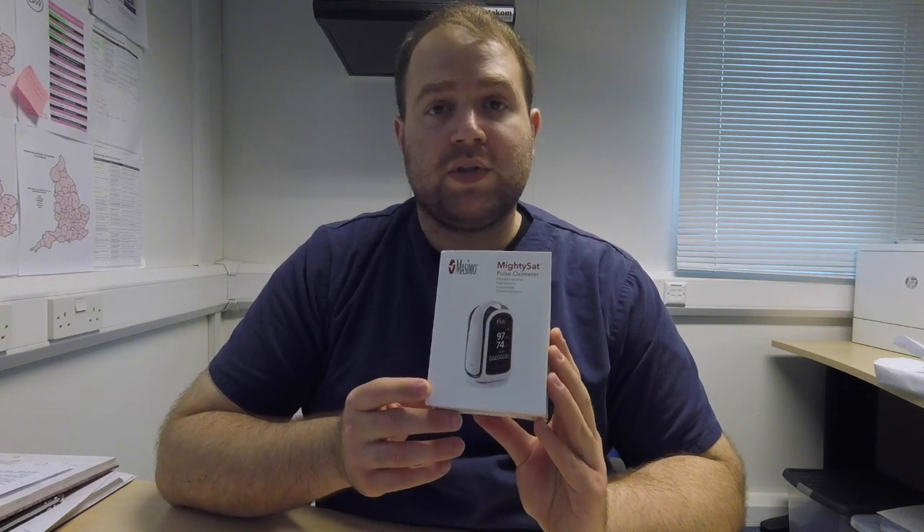Welcome to another EVA equipment video review. Today we start with a question: how many times have you dreamed to get rid of all these cables on your anesthesia station? Some companies are heading towards that direction, including Masimo with their relatively new Masimo MightySat Pulse Oximeter.